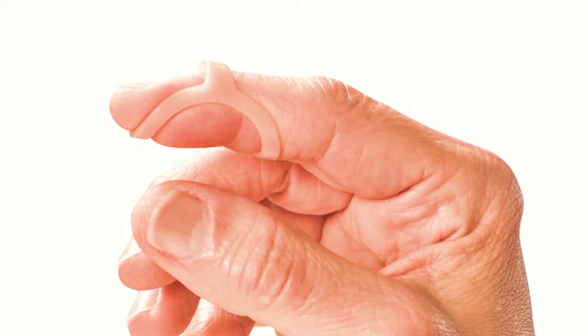Oval-8 splints can be worn on different joints and in different ways depending on what you're treating. For example, when treating a mallet finger, you'll be wearing the splint on the end joint with the band on top of the finger.